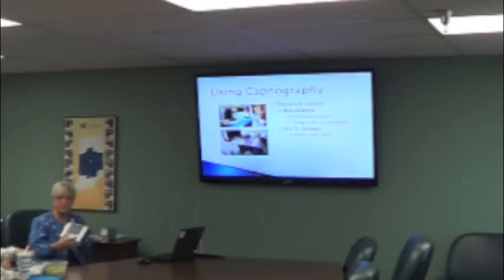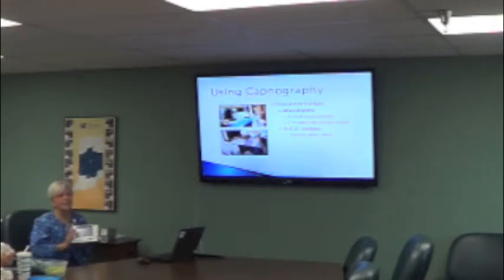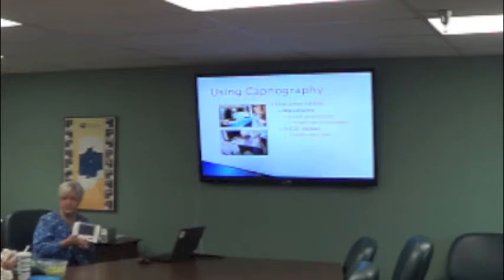Okay. When we use this, we're looking at trends. We're looking at averages over time. We're not looking at, okay, my number's 38 at 10:49, and my number's 42 at 11:15. We're evaluating our patient, and we have a number to go along with that evaluation of how well we think the patient's breathing.